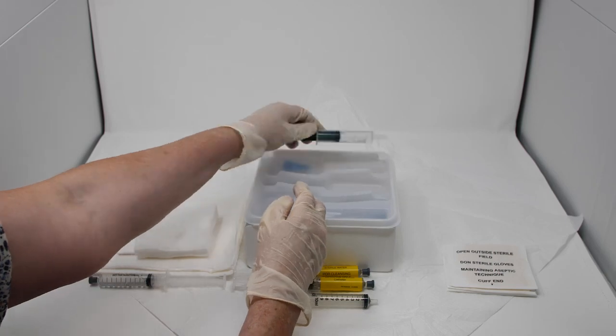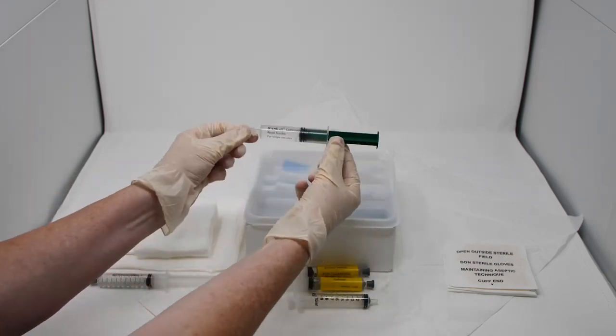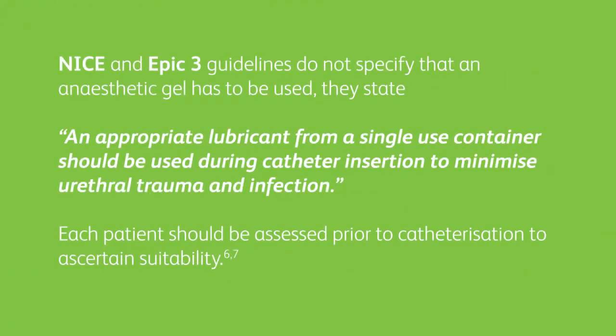There is a 10ml syringe of water-based lubricant gel, Sterilube. Some gels contain chlorhexidine or lidocaine which can cause sensitivities or adverse reactions, but Sterilube has no additional active ingredients and so does not have the same contraindications. NICE and EPIC-3 guidelines do not specify that an anaesthetic gel has to be used. They state an appropriate lubricant from a single-use container should be used during catheter insertion to minimise urethral trauma and infection.